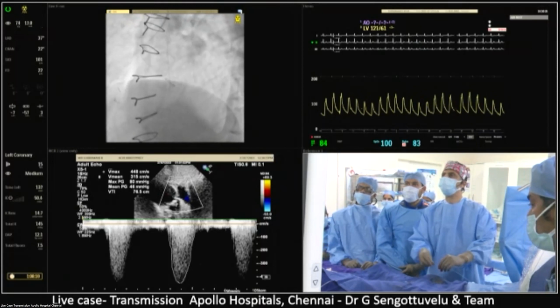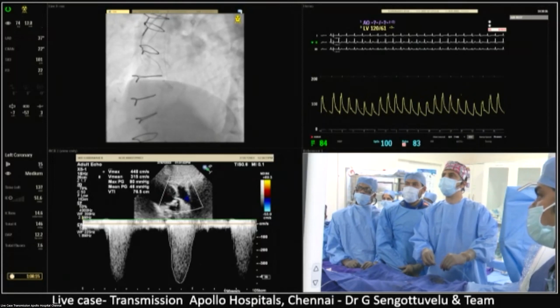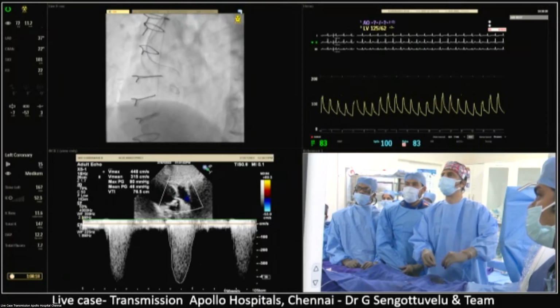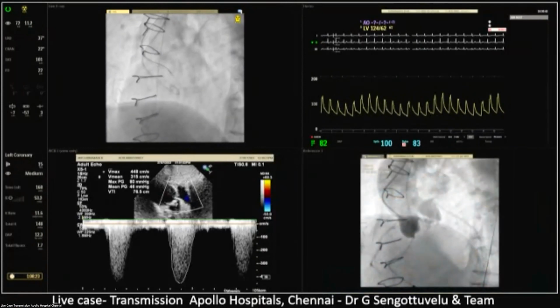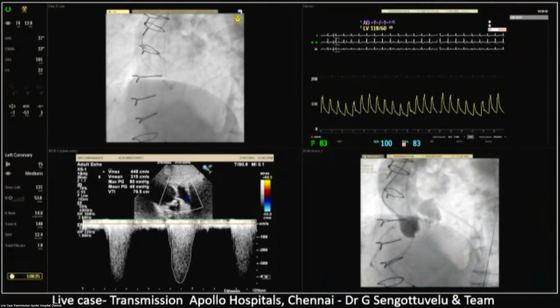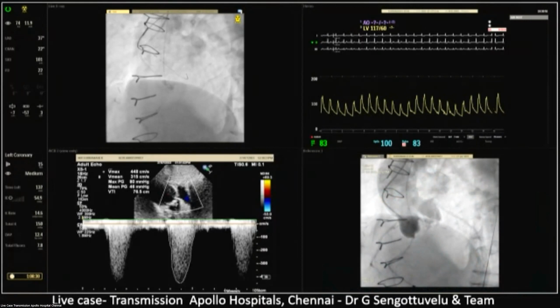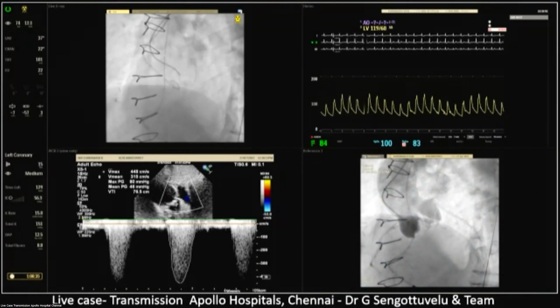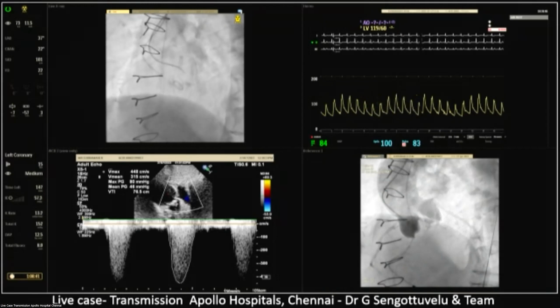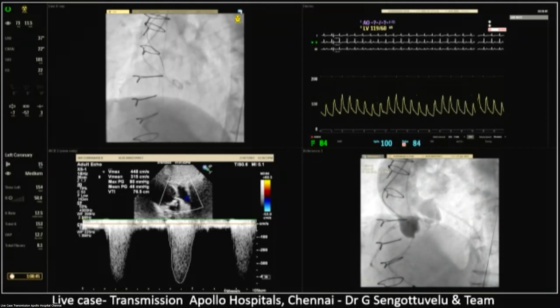There's an AL2 catheter, a straight Teflon wire. Can you make the fluoro bigger, please? Just like the previous case, there's a bicuspid type 0. You may have some difficulty because of the eccentric opening of the valve. Sound good? Yes, I agree. So can we make the fluoro bigger? We still see it in 4 panels. Can we make just 2 panels with the video and the fluoro?